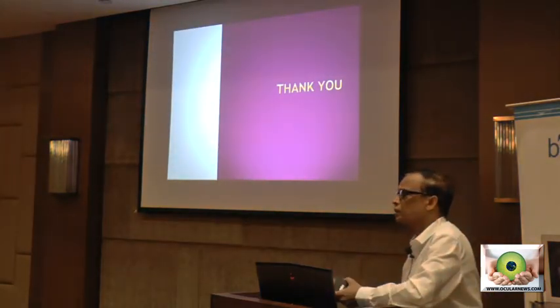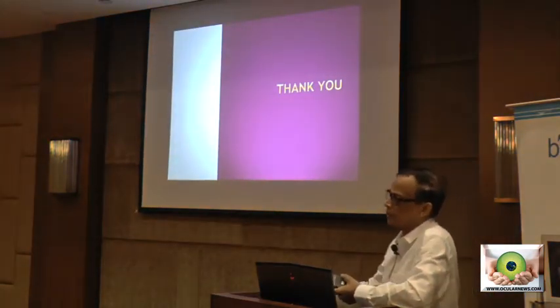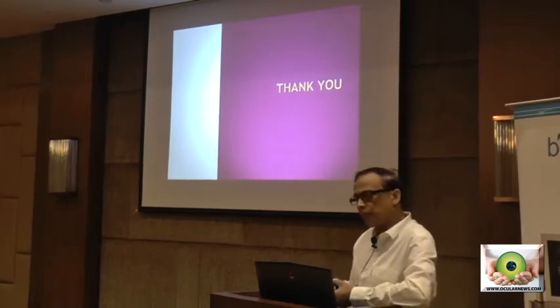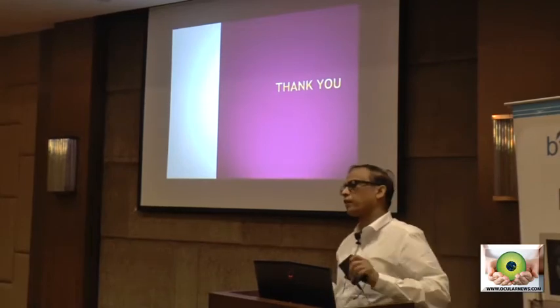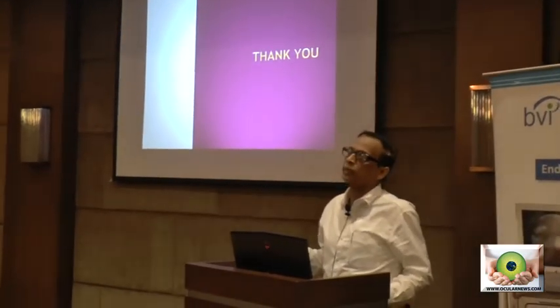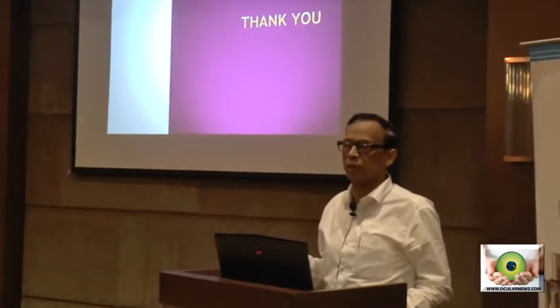In short, this appears to be a very promising procedure for managing cases of glaucoma, and especially more promising when we have to combine cataract surgery with glaucoma, though it has been recommended in all types of glaucoma, whether open angle or narrow angle. In narrow angle also, if there is anterior synechia and we find that the patient is not controlled even after PI, then this procedure can also be done. So thank you very much for the time.